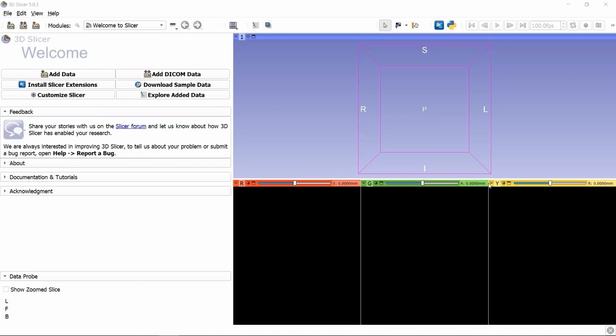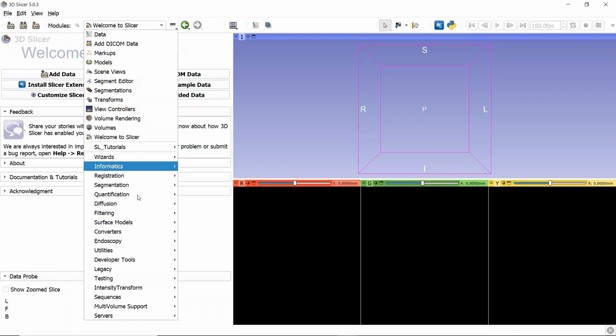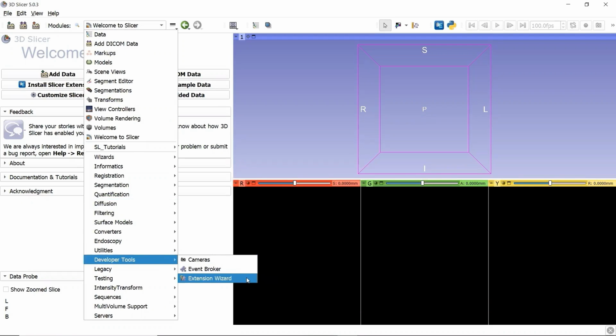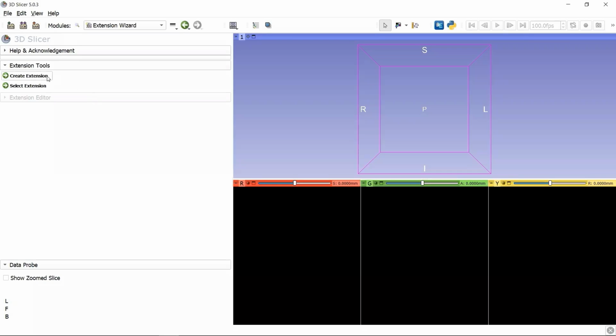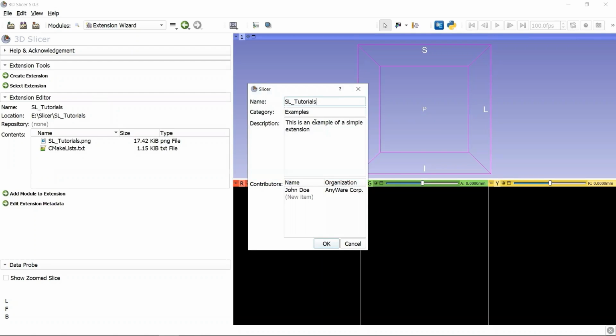Now let's create our custom extension module. We go to the module selection, find the developer tools, and then choose the extension wizard. This is where we can create and manage the extensions from within Slicer. We click the button Create Extension, and give the name of the extension, Tutorials. Give the destination the folder address. Click OK, and then change the category to Tutorials, and change the contributor name, and the organization.